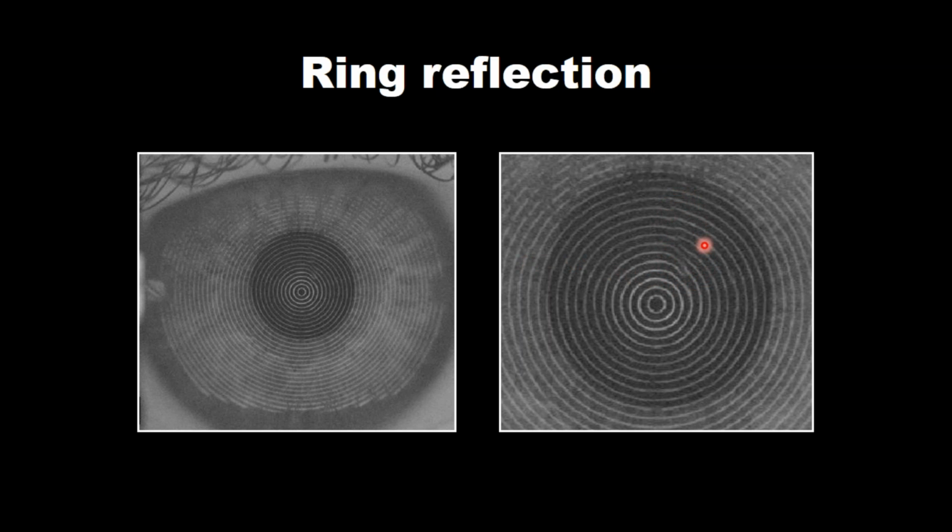So have the patient blink, smooth out those rings. If you can't capture an image within 2 to 4 seconds after the blink, then ask the patient to blink again. If the tear film breakup is measured in milliseconds, then use some artificial tear to try to smooth out that reflection, smooth out that tear film.